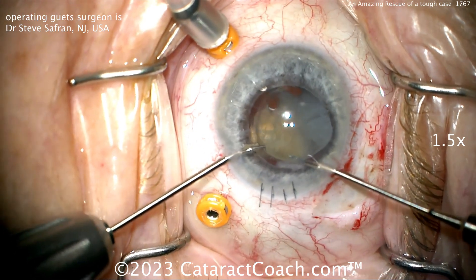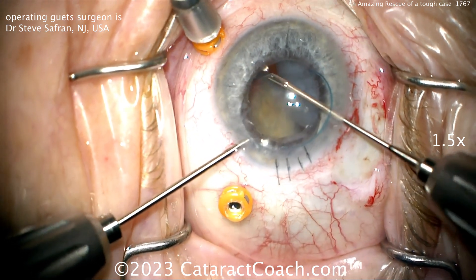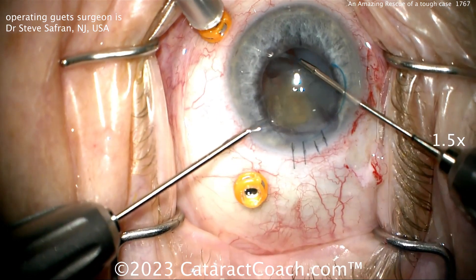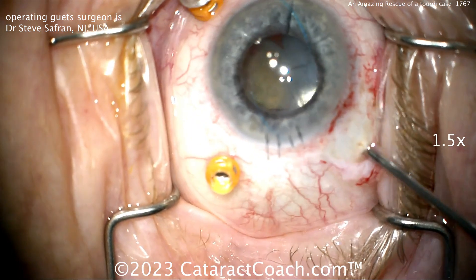He's going to lift this lens up above the iris. With both haptics above the iris, it'll be stable, and then you can explant it or figure out what to do with it later — but you don't want this to fall back into the vitreous cavity. Now with both haptics above the iris, the lens is pretty stable.